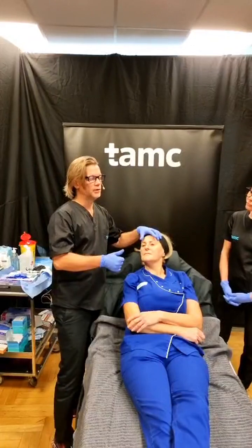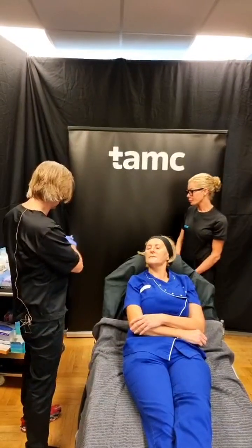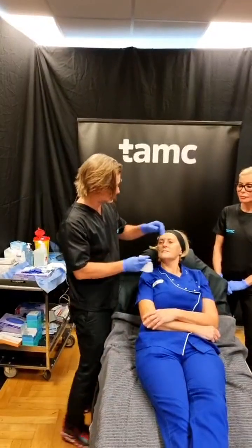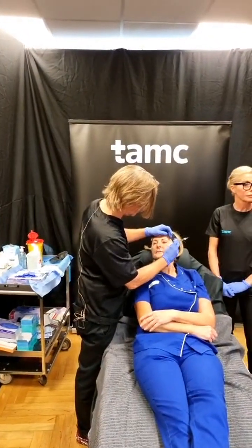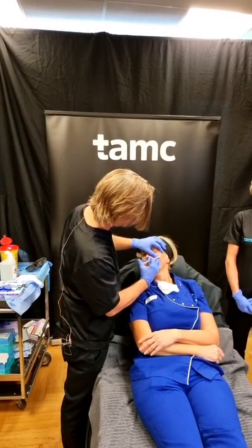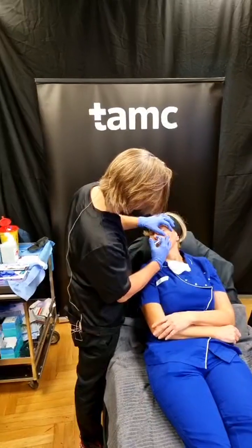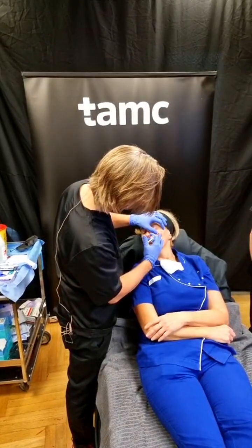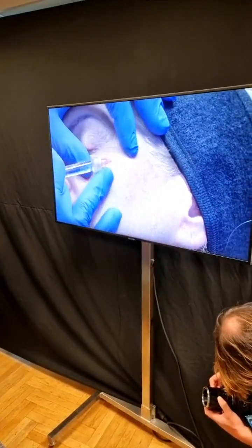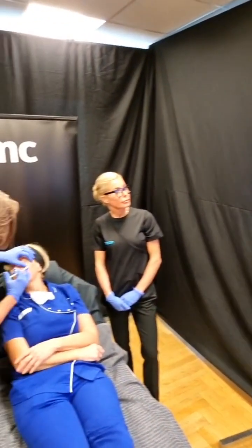So we're going to take one hyaluronic acid and use it for both layers. As I said, the drawing is just for show. You actually can see where the skin wants to be strengthened. If you want to strengthen the skin, you use your hyaluronic acid in the dermis. This is where the dermis is. You can see with every stroke there's a change in that pattern of weakness.